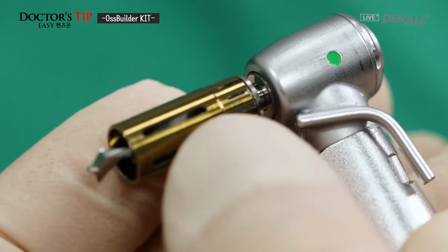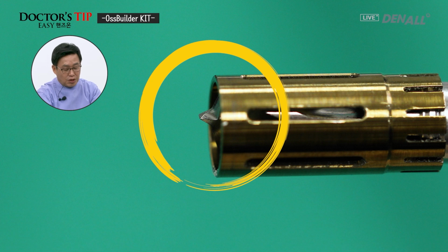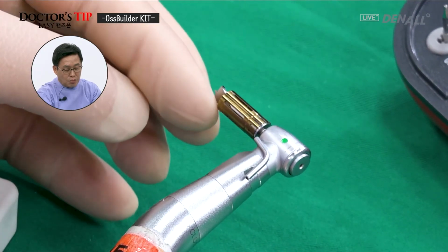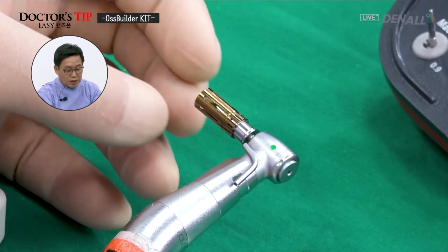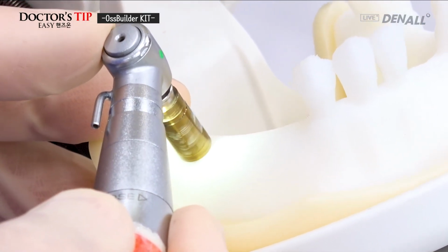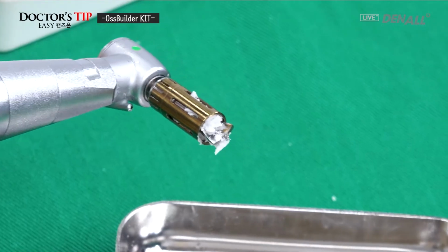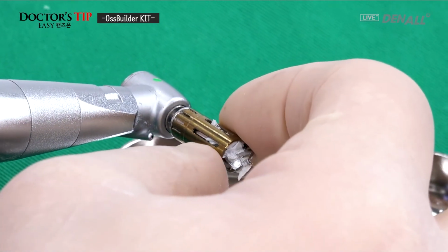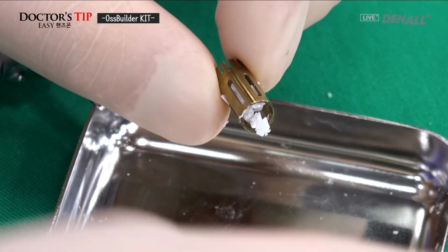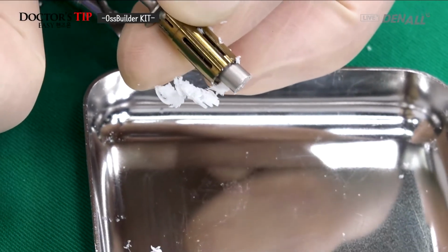As you can see, connect to the engine and pull the metal sleeve up front, and then the tip is barely showing. I'm going to use the autobone collector to harvest bone, and bone chip will be gained in this. You can see that it is collected. Pull, as you can see, as shown, bone chip is gathered here. Remove the metal sleeve. I've removed it. The chip within the metal sleeve, you use bone ejector to get them out.